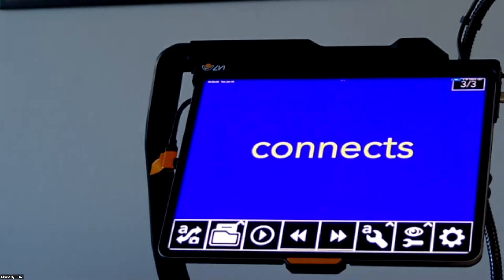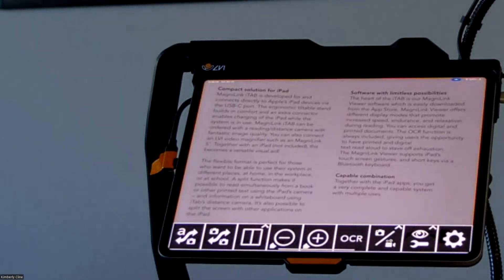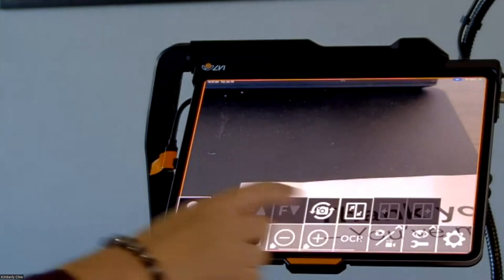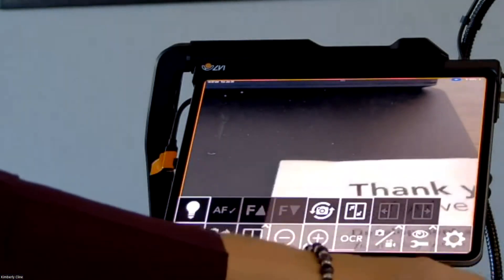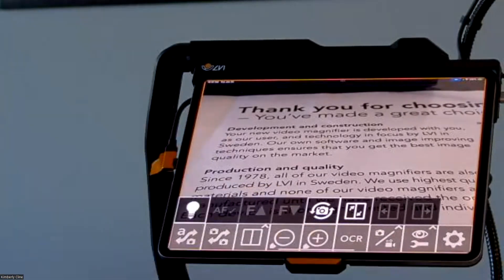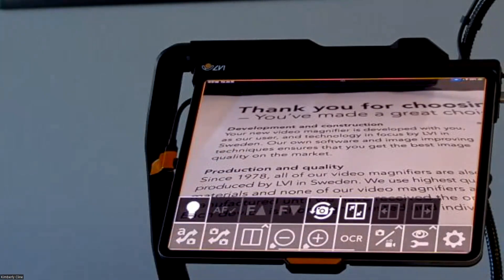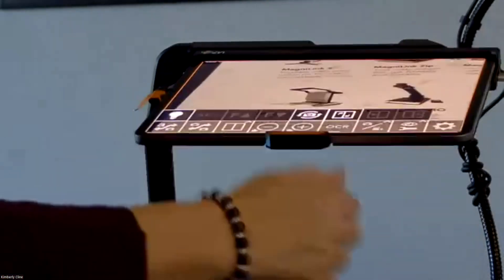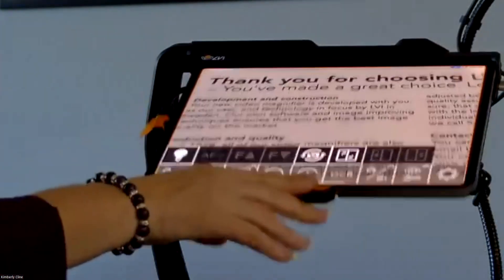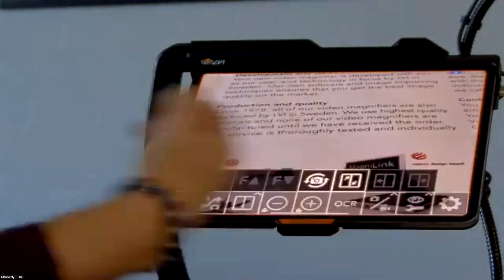There is no angle correction in the software currently. On battery life: in continuous use the iPad battery lasts about an hour and a half running this solution, which is why the hub was integrated into the stand — so you can charge while in use and run as long as needed. The TTS reading speed can be changed to whatever you prefer, and the voice can also be changed.